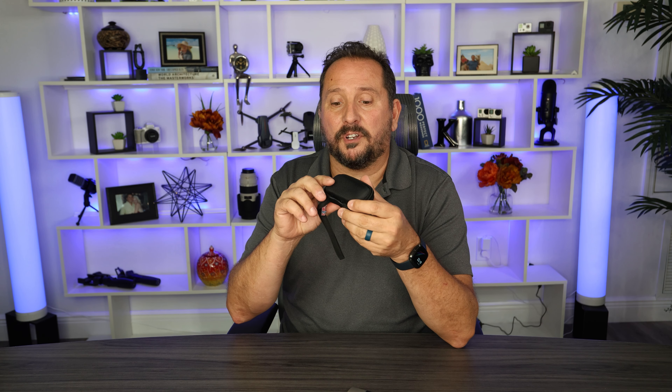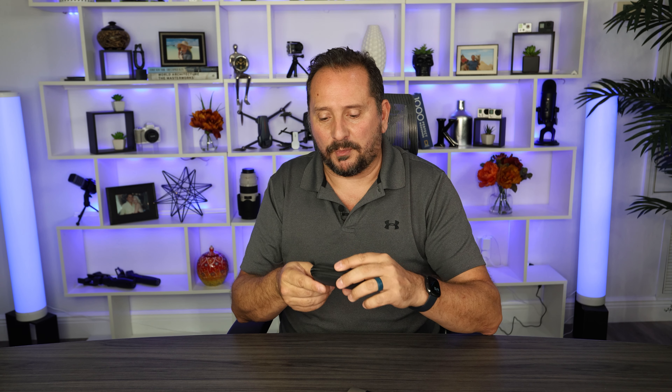I'm gonna keep this short and sweet for you. You just got yourself this magical little device. As much as we would rather not have this, those of us who need it had to buy this. And then what do you not want to do with this little naked aluminum thing? You don't want it ruined. So you get this case and you're watching this because you want to know if this case actually works or makes sense.